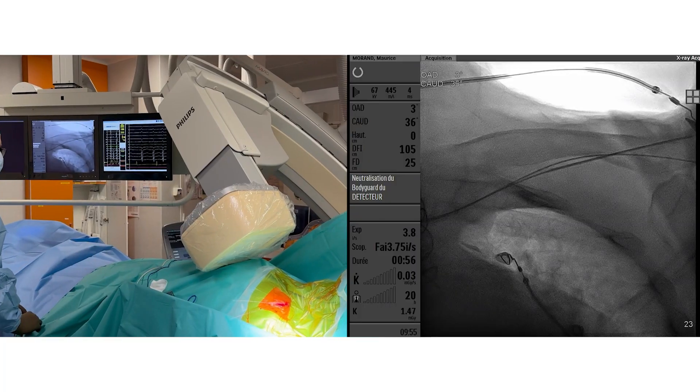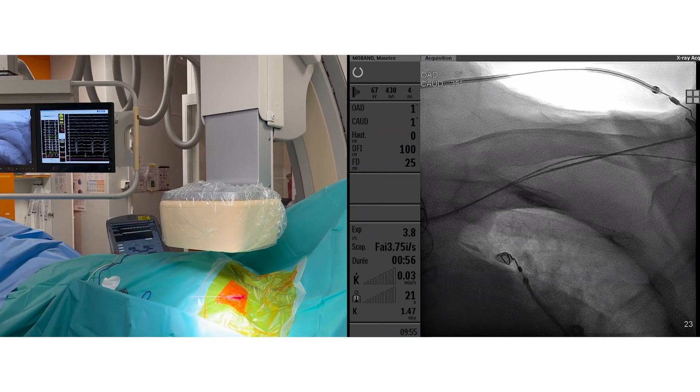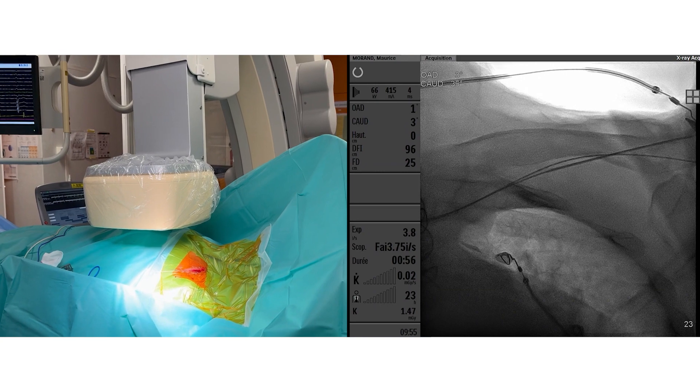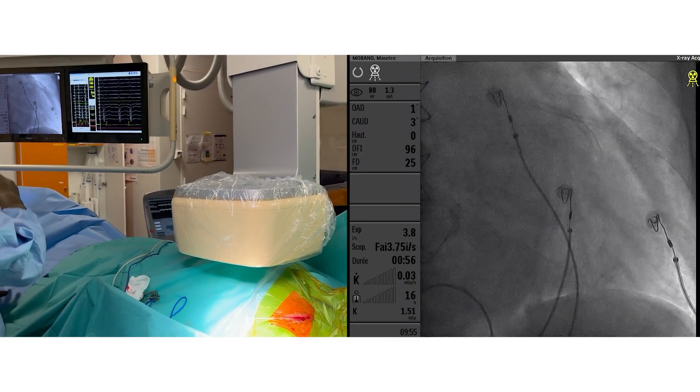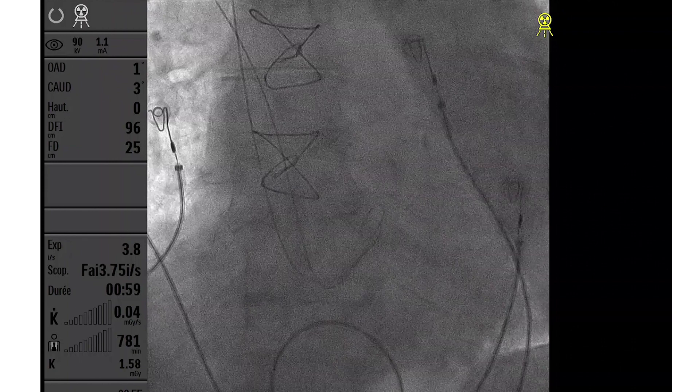Before advancing the introducer over the guide wire we need to make sure that we have not punctured the artery. By moving the fluoroscopy tube over the heart and into a posterior position we can check whether the guide wires are in the right atrium.